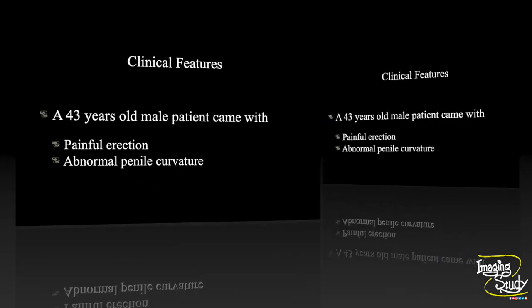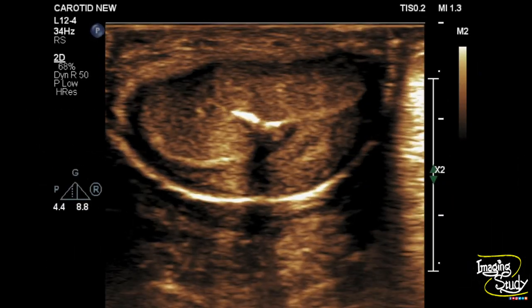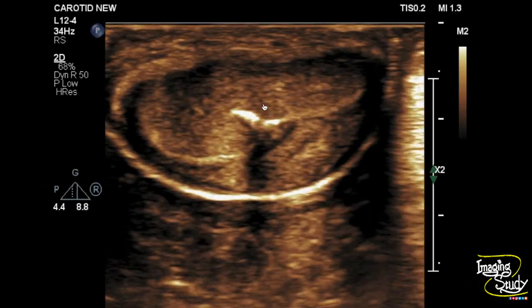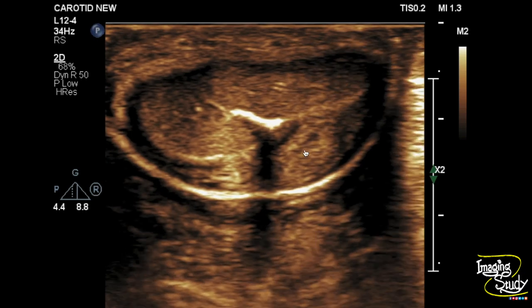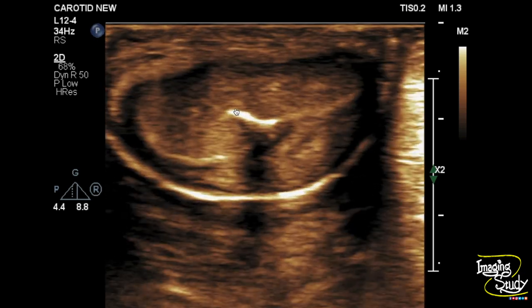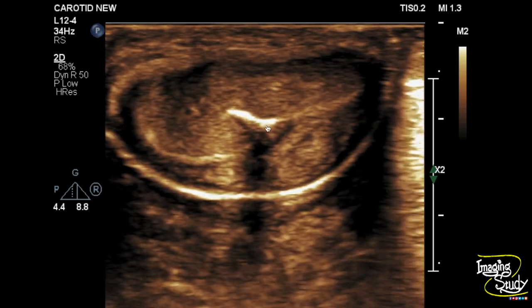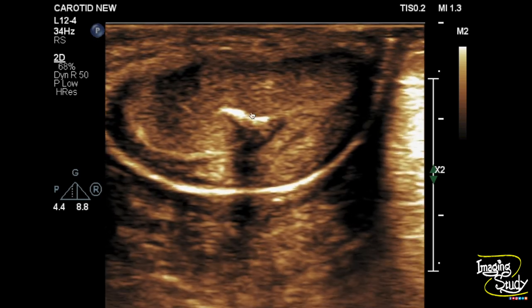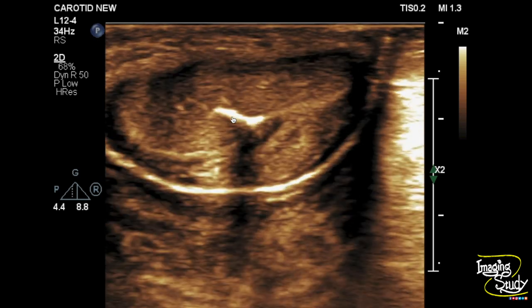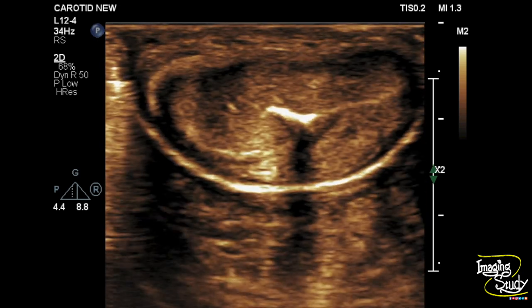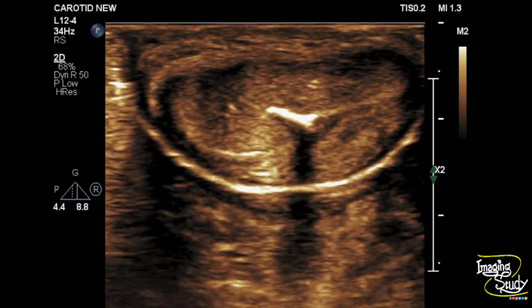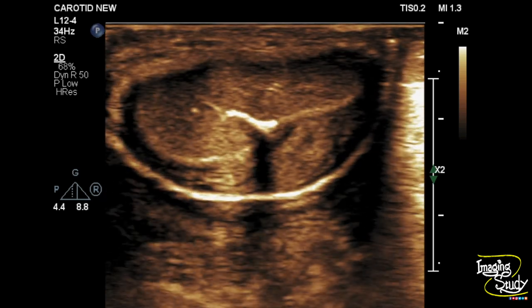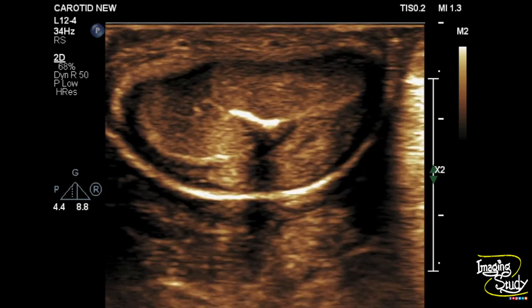On ultrasound, here you can see the transverse section of the penis — these are the corpora cavernosa and this is the corpus spongiosum. You can see a hyperechoic calcified area casting posterior acoustic shadow within the tunica albuginea between the two corpora cavernosa. This is a calcified plaque within the tunica albuginea, which suggests a case of Peyronie's disease.